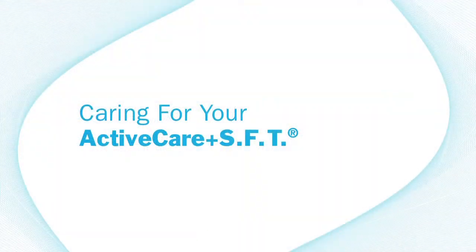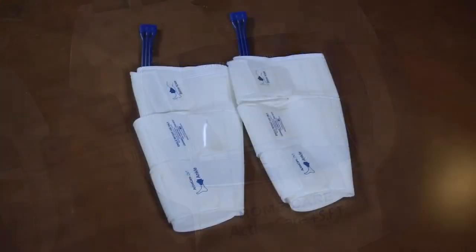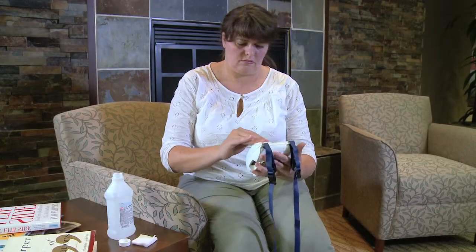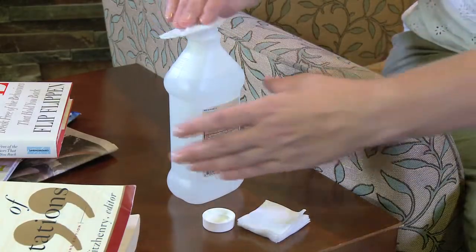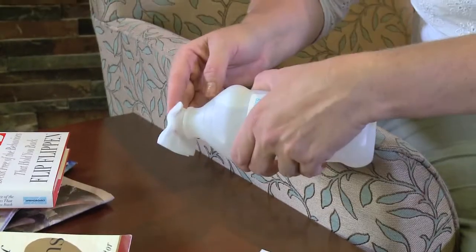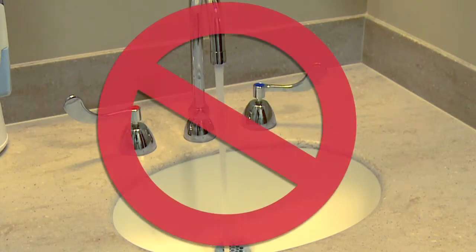Caring for your Active Care Plus SFT: the system is easy to care for. All components have been cleaned beforehand, so there's no need for additional cleaning. The disposable sleeves are for your personal use only — they should not be machine washed; just wipe down with a damp cloth. If you must clean any other part of the system, use a cotton swab pad dampened with a 70% alcohol-based solution. Do not wet the pump or bring it into contact with water.